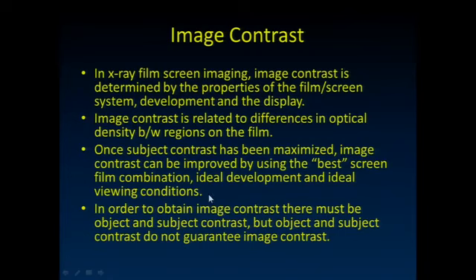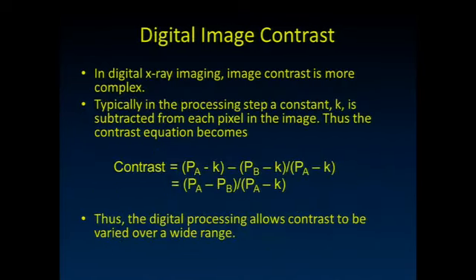And then the next thing is the image contrast, because now I have to stop those things and detect them. Or in the MR example, I have to detect that signal intensity that's coming out of the tissue and measure it. And that may result in some degradation in that information as well. And that's the imaging contrast. Is there enough difference left that I can make an image out of that?